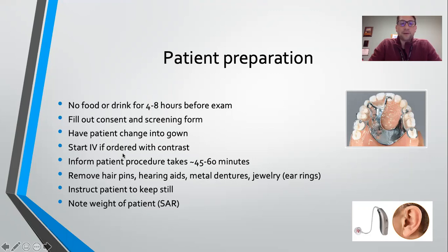Fill out consent form, all that stuff is the same. Most of the time when you're doing abdomen, it's going to be with contrast, and you're going to hook them up to the power injector because you're doing dynamic imaging. You're imaging during the arterial phase, you're imaging during the venous phase, and you're imaging during what we call a delayed phase. So IV with power injector.